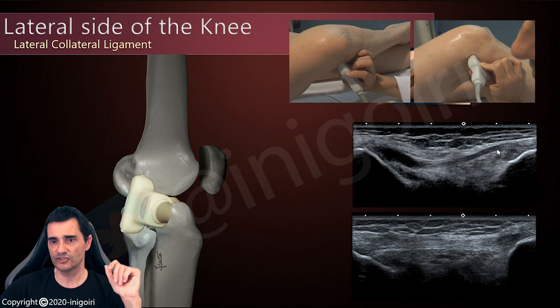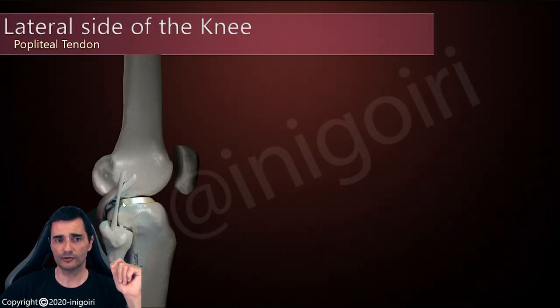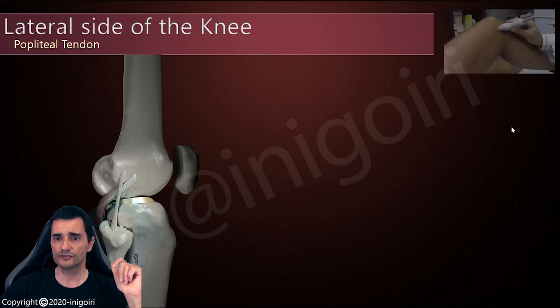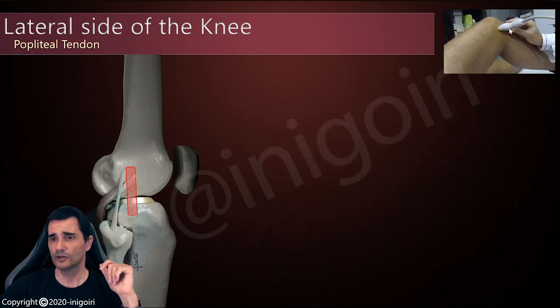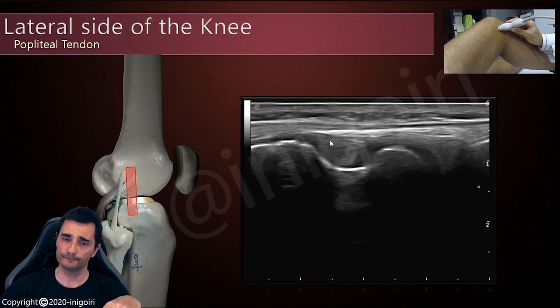This is the same patient with the ligament tense in this position. This is the condyle, this is the fibula, the head of the fibula. The popliteal tendon is below the lateral collateral ligament. To locate this tendon, we will place the probe over the joint line, slightly proximal, and we will find the popliteal fossa in the femoral lateral condyle, and inside you will find the popliteal tendon, like an oval-shaped tendon located inside this fossa.